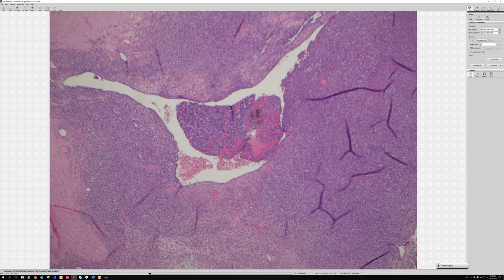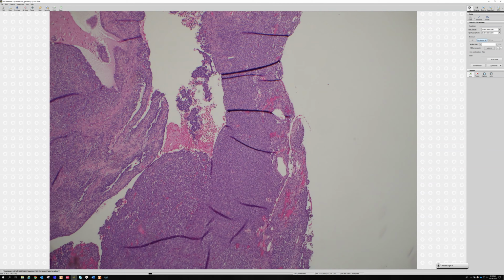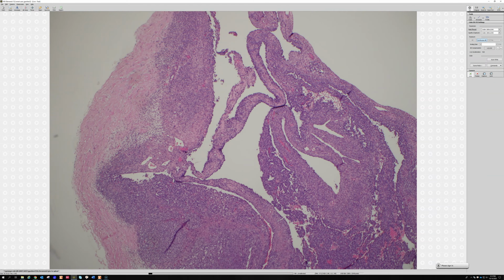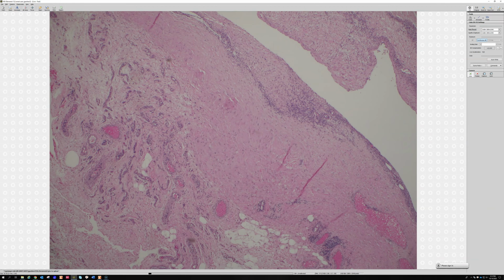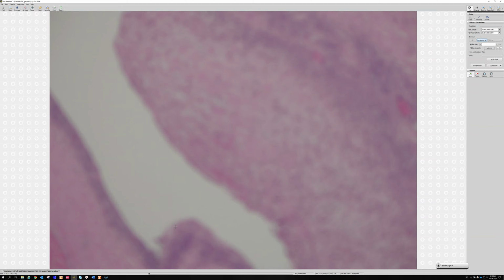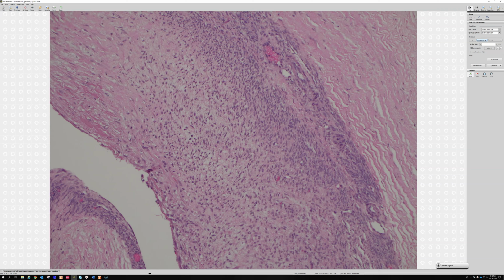And then synovial sarcomas often have dilated branching staghorn kind of vessels. Like see these dilated open vessels, similar to the vessels you see in a solitary fibrous tumor. So I think solitary fibrous tumor and synovial sarcoma can be a really close mimic of each other sometimes. And you can sort that out with additional testing. Let's see, what was the next question on the sheet? What kind of molecular abnormality do you find in synovial sarcoma? SS18, SSX. Yes, exactly. SS18 with SSX either 1, 2, or 4.